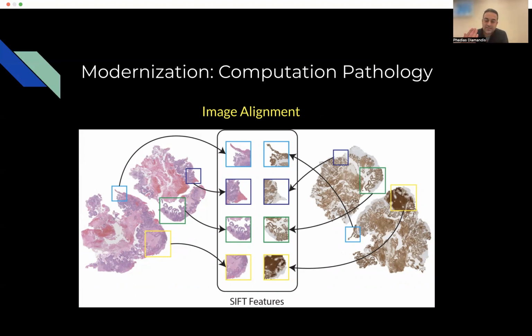And this is laborious because you've got to go to the H&E slide, align it in your brain with the immunohistochemistry slide of interest, and then try to estimate what proportion of a slide is positive. What computational pathology will eventually allow you to do in a routine way is to align these slides together so you can examine them together in a more harmonious manner.